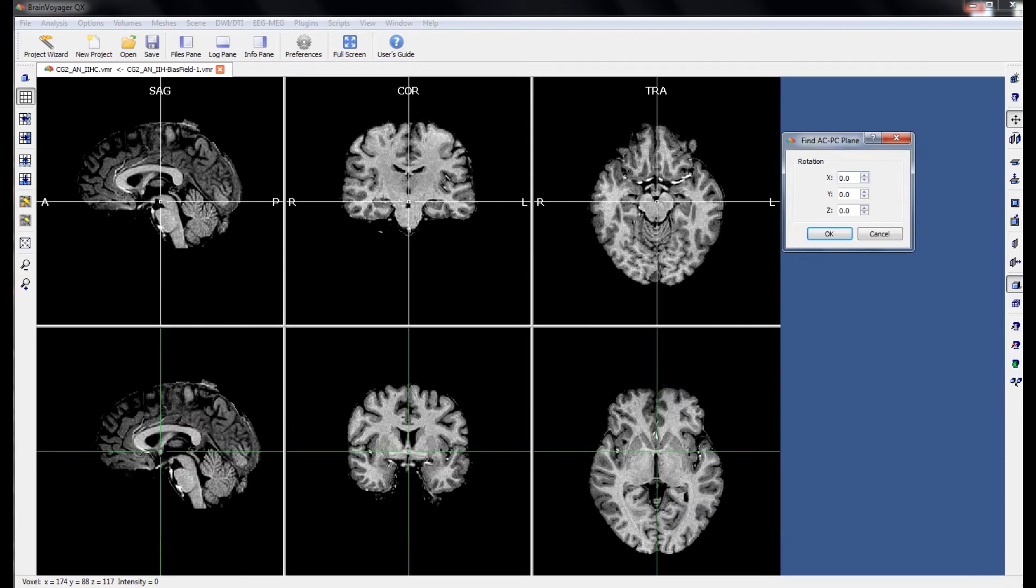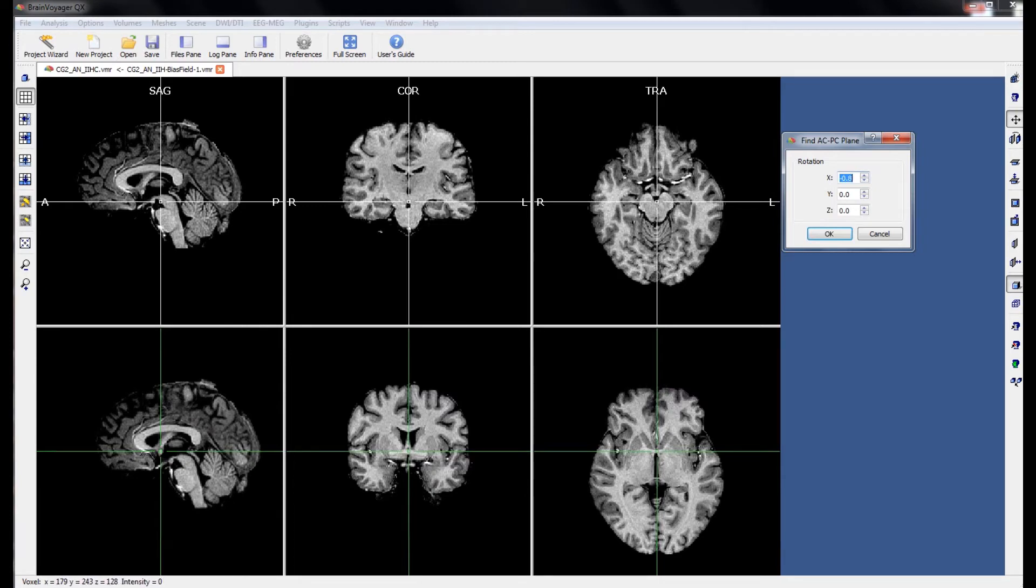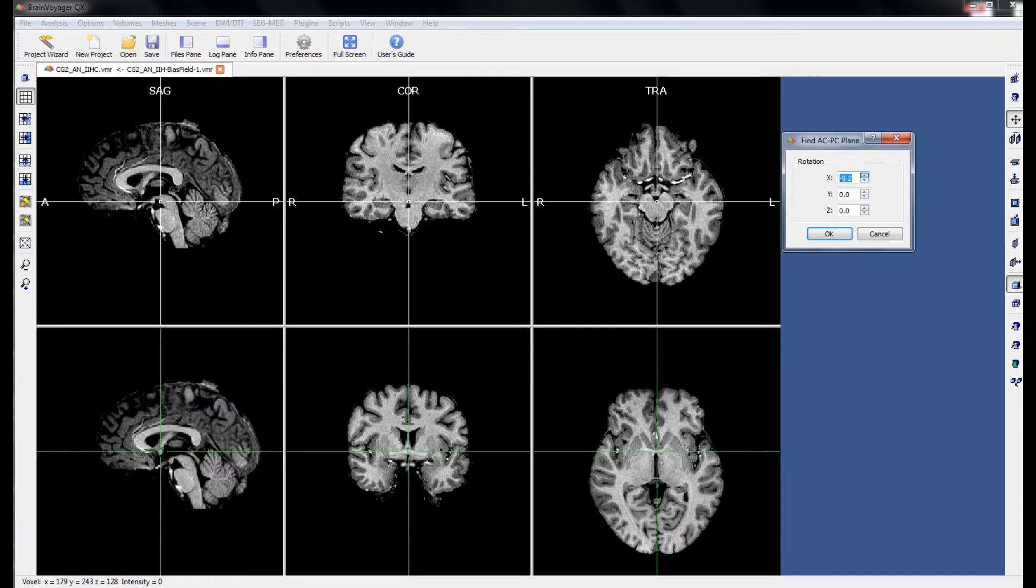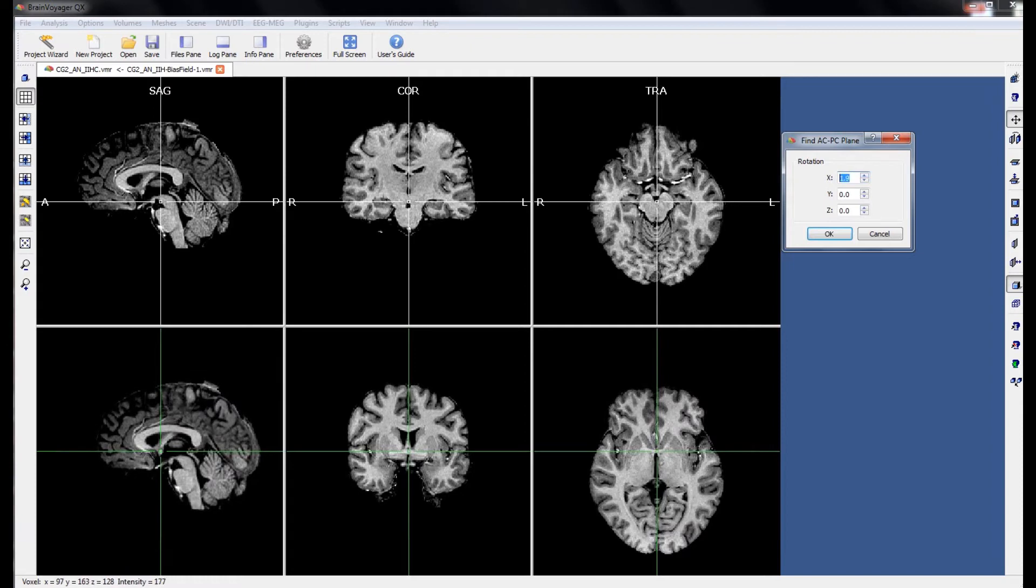and changes in the Z rotation will pivot the brain in the transverse window. The goal here is to make changes in the X rotation and find the point at which the posterior commissure first bridges and becomes well defined.